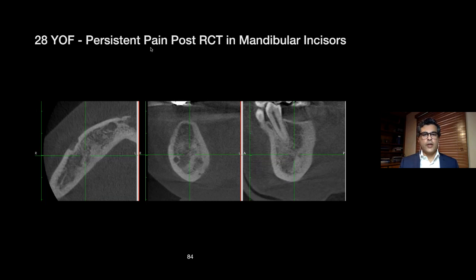but talking about thoroughly evaluating the whole scan, not just the region of interest, which is the mandibular incisors, but the whole scan. So when this scan was being interpreted, the right mandible, which you're seeing here, is widened. It seems like it is expanded compared to the left side, and the bone has changed. So the patient was pregnant, and these are typical signs of fibrous dysplasia.